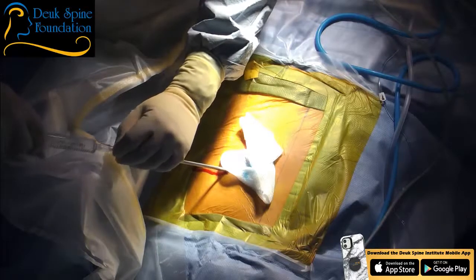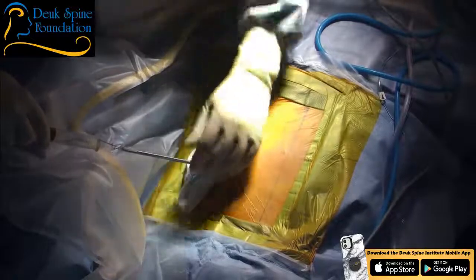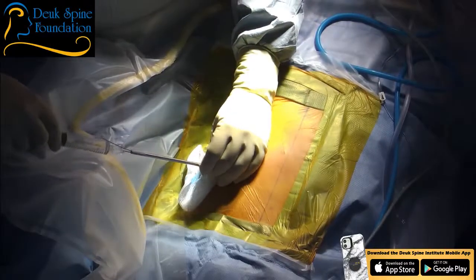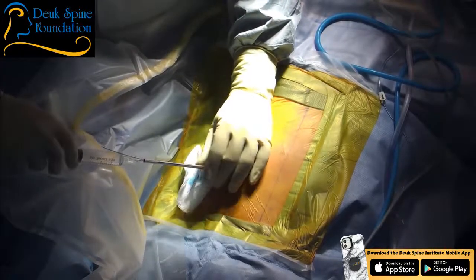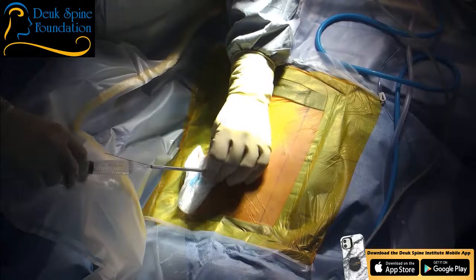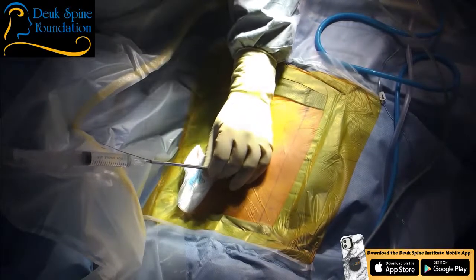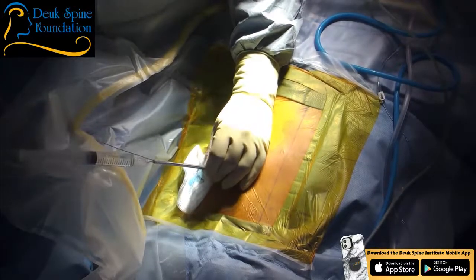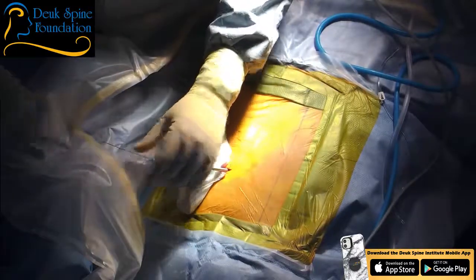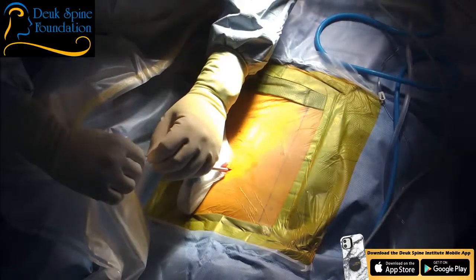Are you comfortable? Yeah, I'm giving you some numbing medicine as I'm doing this, but I don't want to put any down by your nerve, otherwise you're going to have some weakness, which will be from the medicine itself. Maybe numbness. Just let me know if it gets really uncomfortable for you, okay? Can you hear me? All right.